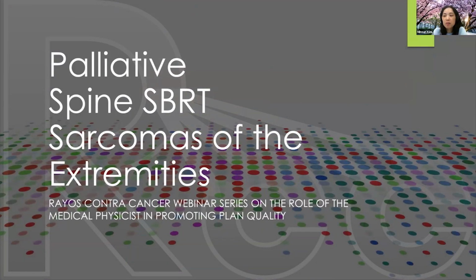The topic is the site-specific physics plan review focusing on palliative, 3D palliative, and SBRT spine, and sarcomas of the extremities.